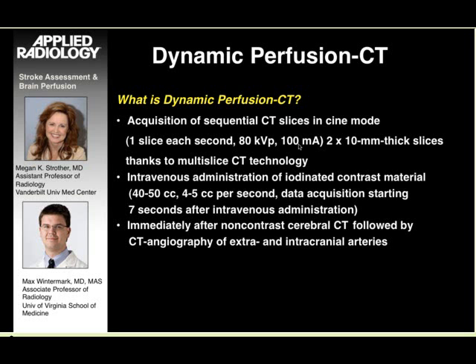You are still usually going to obtain a non-contrast CT prior to the perfusion CT, and you're also going to still obtain a CT angiogram either before or after the CT perfusion, but the CT perfusion data is going to be used by itself to calculate those perfusion maps.